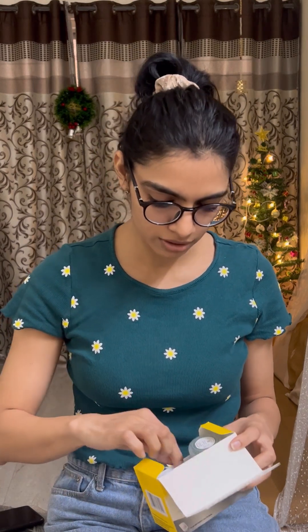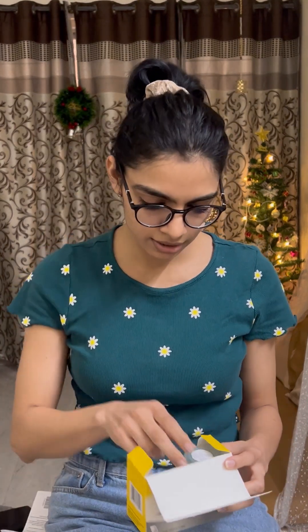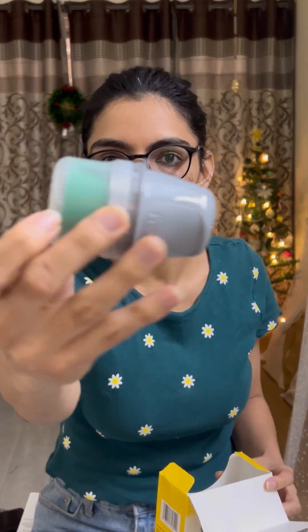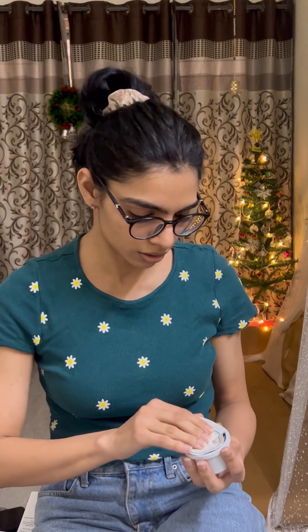I have opened this box. The first thing I get is the manual, then I have the applicator, and this is the sensor that you will be getting in the box. I'll quickly open the sensor and tell you how to apply it.